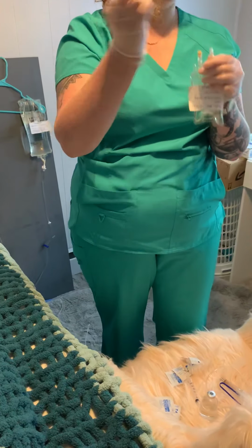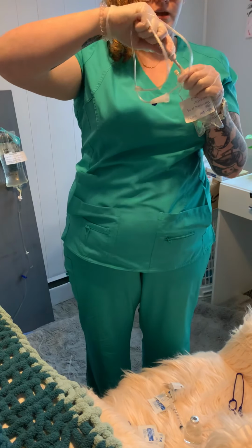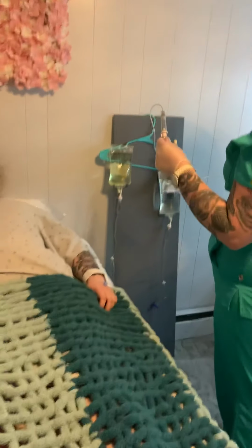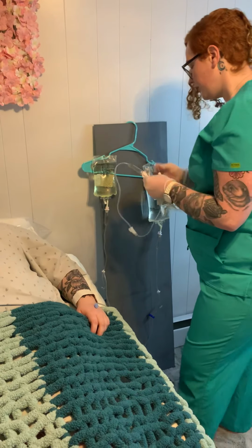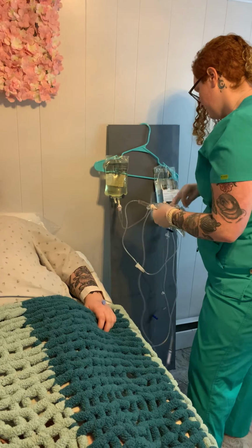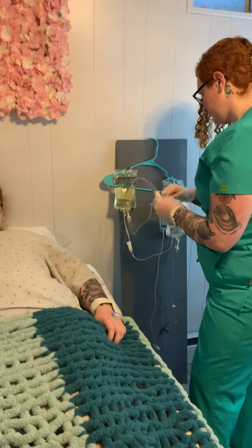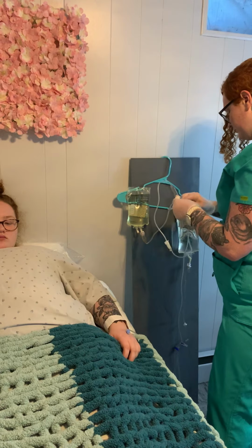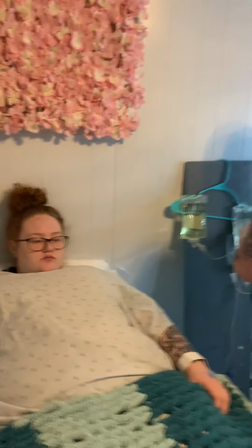At this time, we'll remove the blue cap from the IV piggyback, spike the bag while maintaining sterility. Alcohol the upper port on this tubing of the flush bag. And we will back prime until half the chamber is full with liquid.